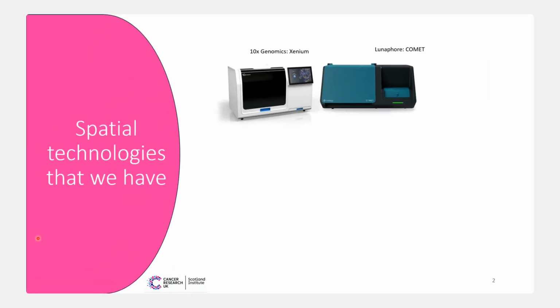We are anticipating its arrival, but we're hoping to get that quite soon. This can do more or less up to 100 proteins, maybe more, depends on how much we want to push it to its limits. We have the Akoya PhenoCycler-Fusion, and currently we've done around 43 proteins.